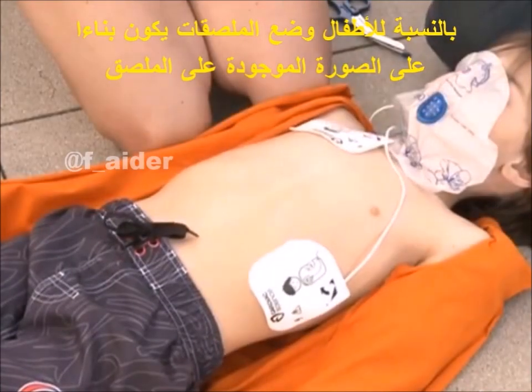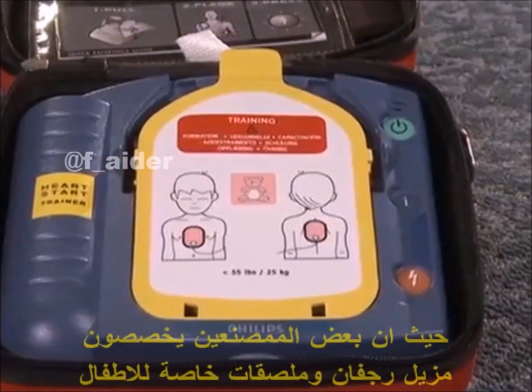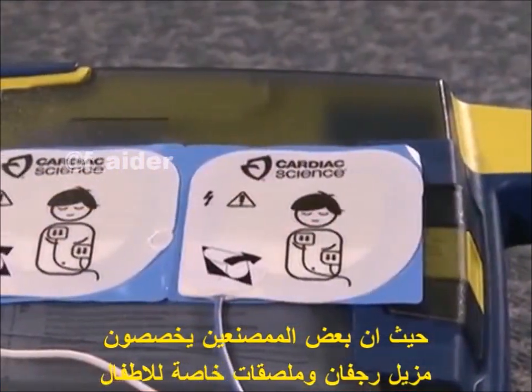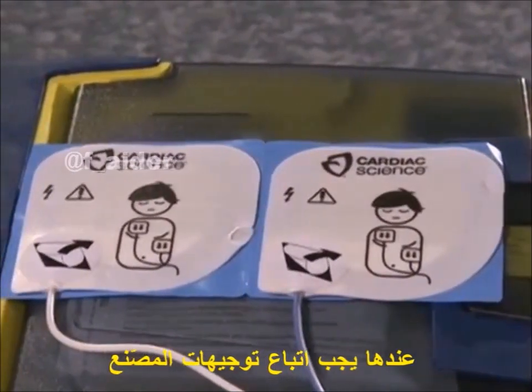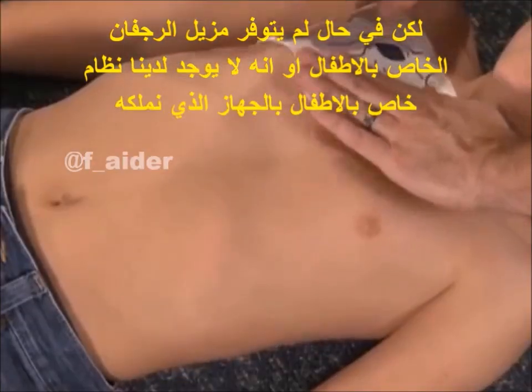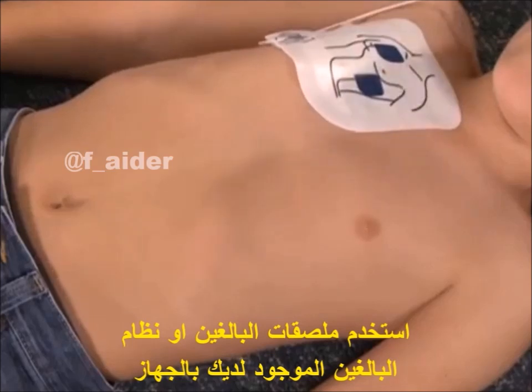Note the placement illustrations on pad packaging or pads themselves. Some AED manufacturers use child-specific defibrillator pads and machine settings. If so, follow the manufacturer's directions. If child pads are not available, or the AED does not have a child key or switch, use the adult pads or adult settings.